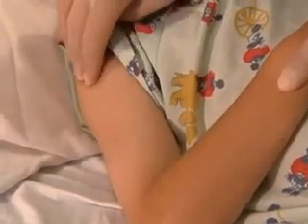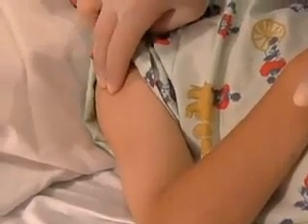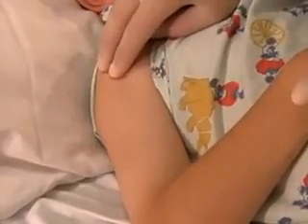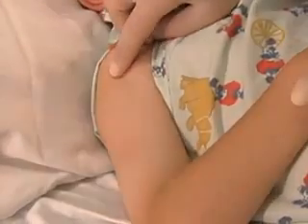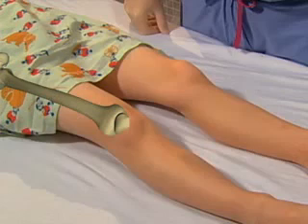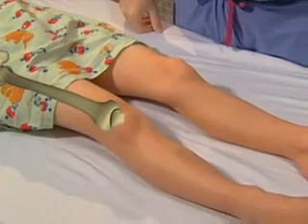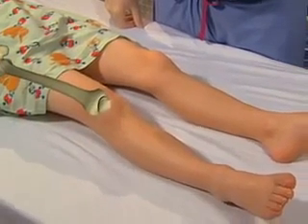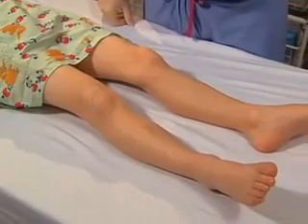Just anterior to the midline of the lateral shoulder and distal to the shoulder joint. This bony prominence is the insertion site. The distal femur can be cannulated for intraosseous infusion, though abundant overlying soft tissue and muscle often make identification of bony landmarks challenging. Therefore, this site should be considered when the use of tibial and humeral sites is contraindicated.